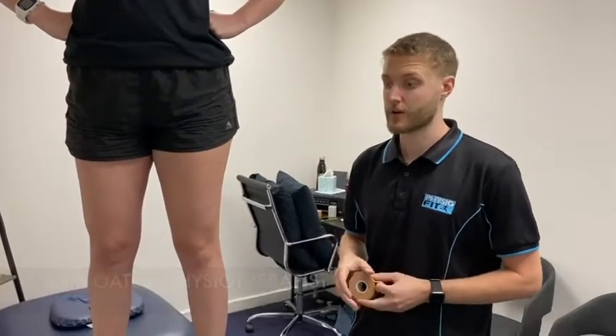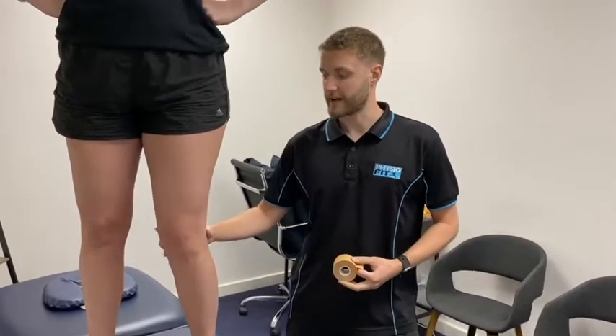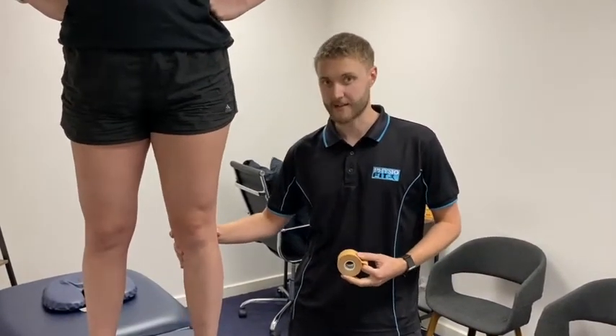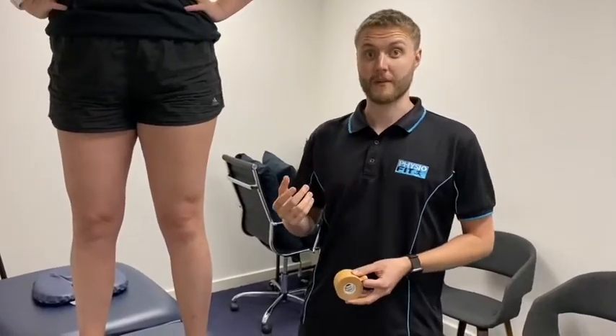Hey guys, I just want to run you through a simple ACL tape today. What we're going to do is essentially prevent that knee from coming quickly into that extension position. We're going to provide a bit of support with the rigid tape and then do an elastic wrap over the top of that.